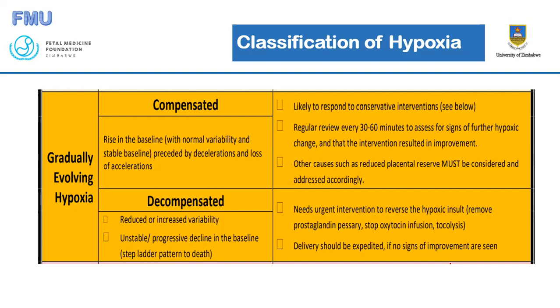Thank you very much. I also wanted, because I thought it would be necessary to inform people, that not every patient needs a CTG. And I also wanted to ask about mobilization of patients. For example, you put a patient on CTG. We know that these are women who are already at risk of DVT. How long should we put a CTG on a woman? For example, if a woman has fetal distress and it corrects, and after monitoring on CTG you notice it is now okay, or it remains abnormal, how long should we keep them immobilized because they're on CTG?